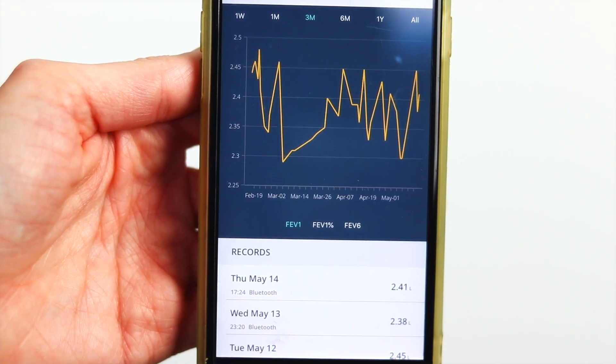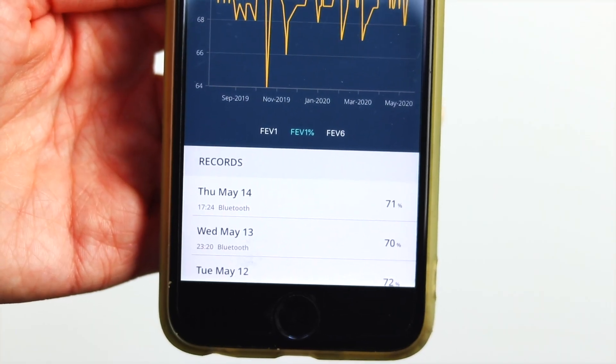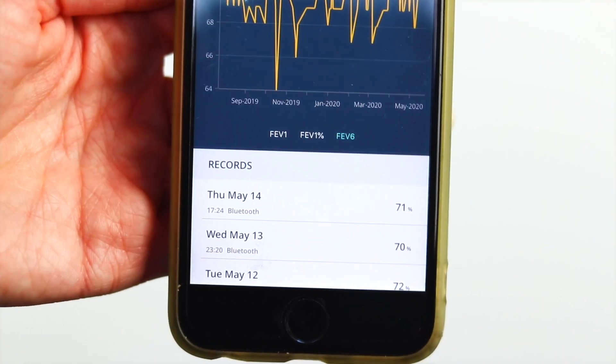When you have more than one entry in your app, the graph will begin to draw. You can change the view over time by pressing one week, one month, six months, etc., as well as see your FEV1 percentage and your FEV6. And that's it — remove the mouthpiece for washing in warm soapy water, ready for next time.